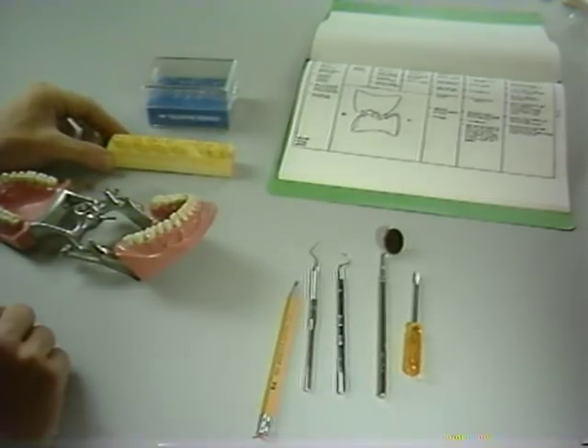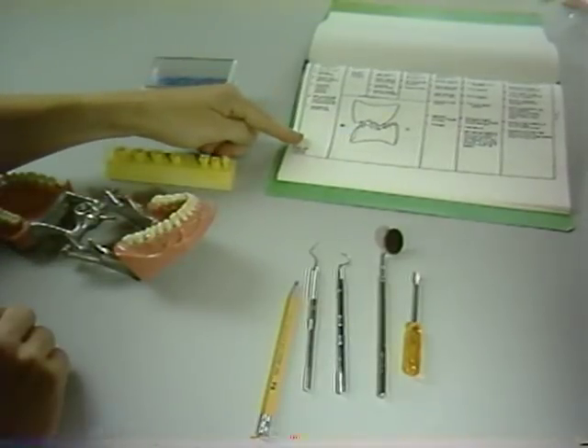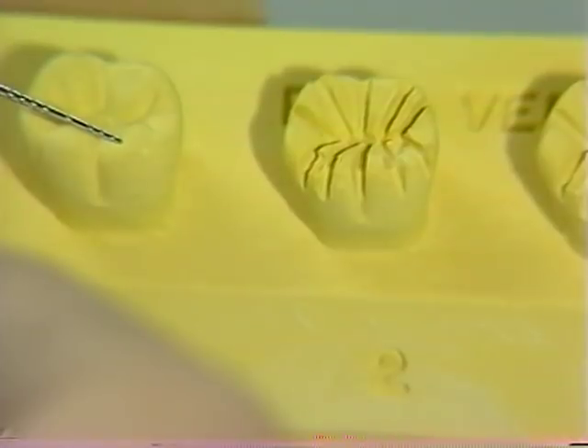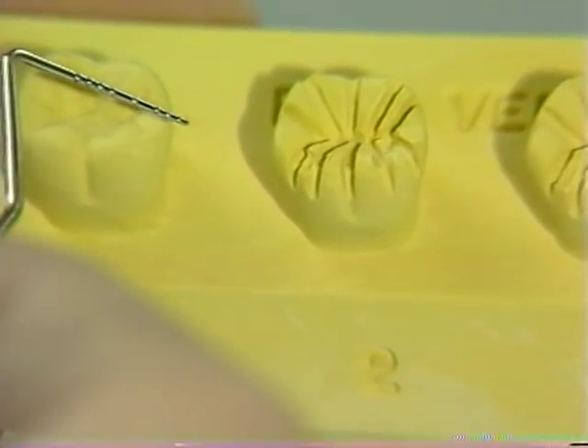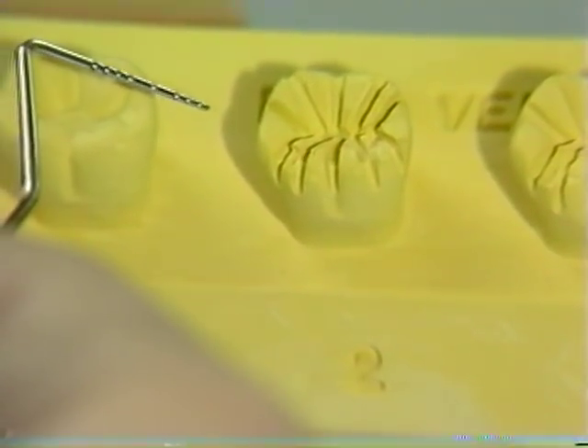The step-by-step model will be used in conjunction with the step-by-step handout in your syllabus. The first step is the placement of depth grooves, or guiding grooves, in the occlusal surface.